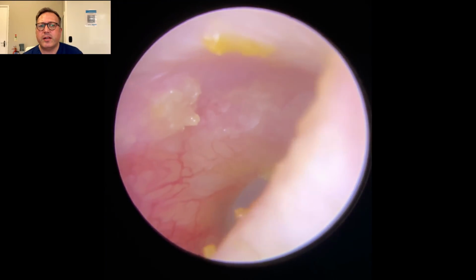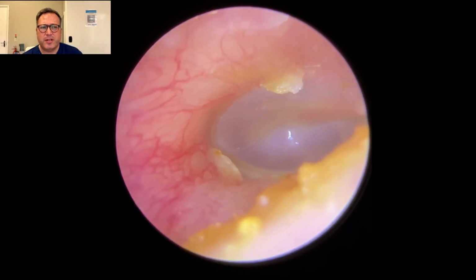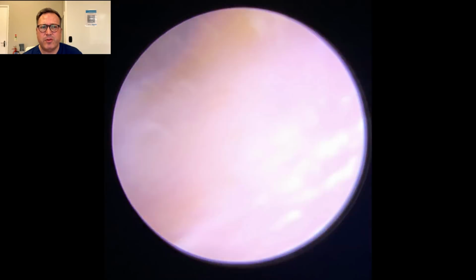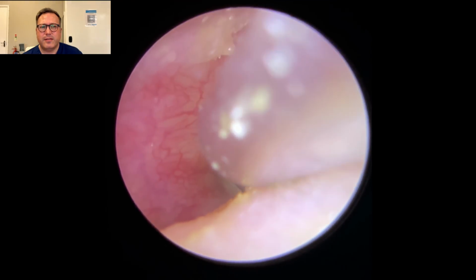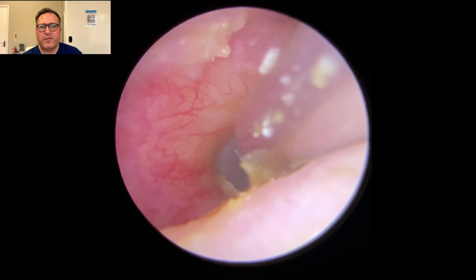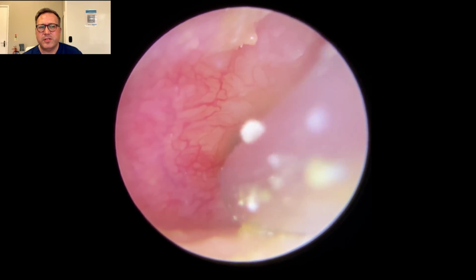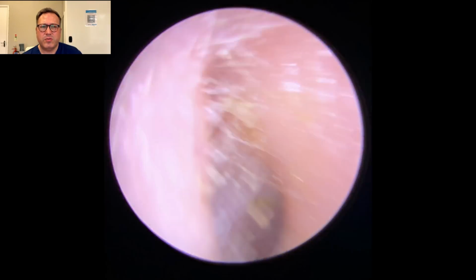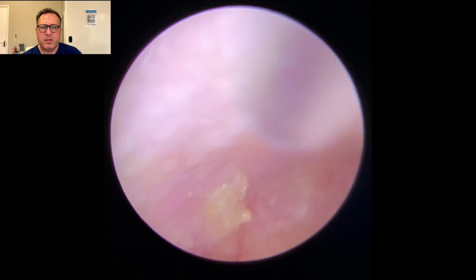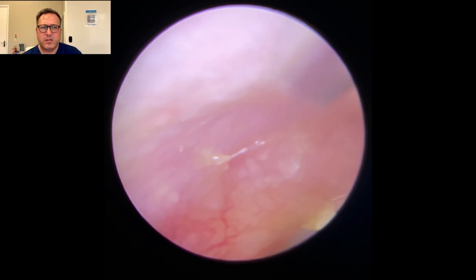So just taking away some of the looser bits of wax there. You can see we've just got a couple of little bits and bobs left in there, so we'll just grab those few little things. Just taking away this little lip at the front, so you can see there's a little bit of wax, a little bit to the left as well. We'll just take that away, there we go. And we've got these two little pieces a bit further in. Just going to slowly creep up.